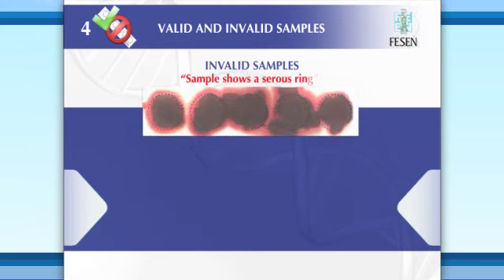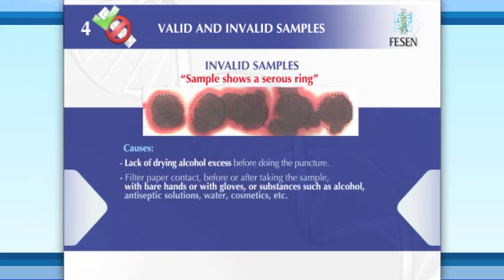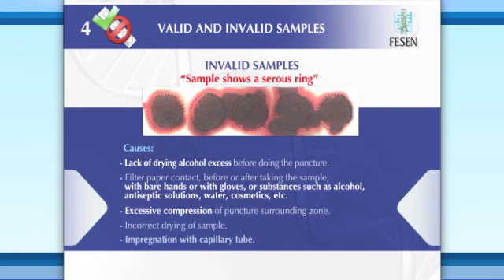Sample shows a serum ring. Causes: lack of drying alcohol excess before doing the puncture. Filter paper contact before or after taking the sample with bare hands or with gloves, or substances such as alcohol, antiseptic solutions, water, cosmetics, etc. Excessive compression of puncture surrounding zone. Incorrect drying of sample. Impregnation with capillary tube.